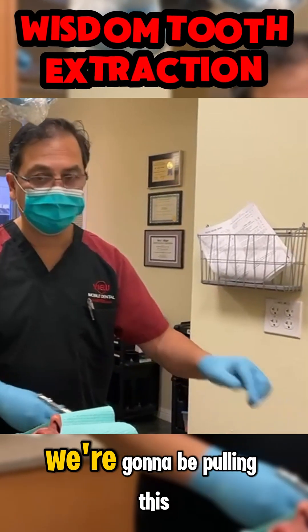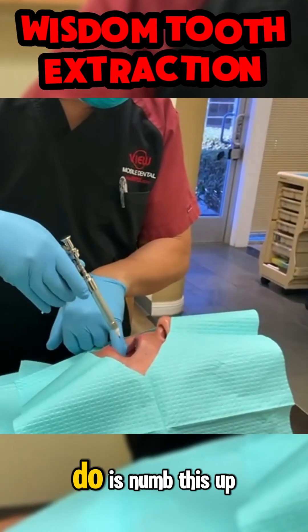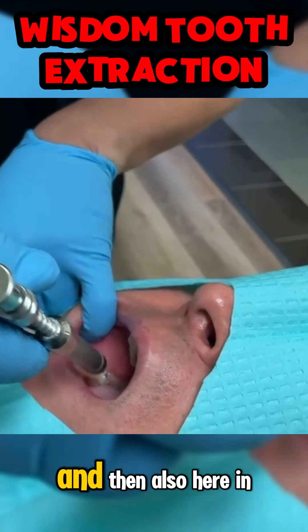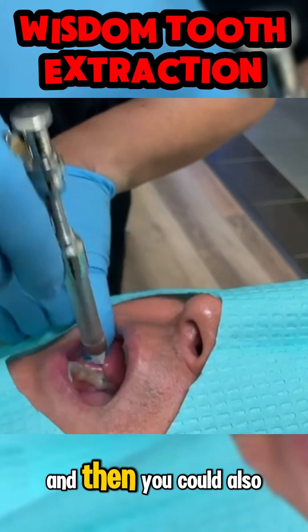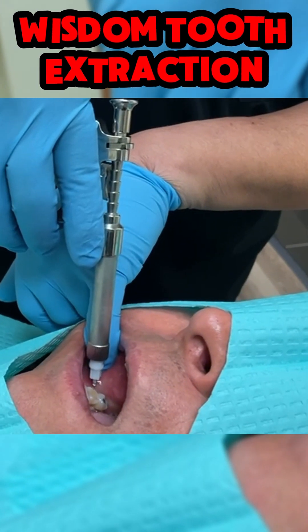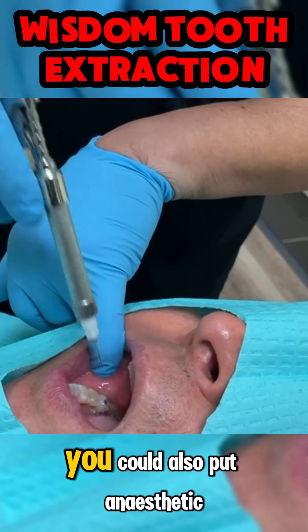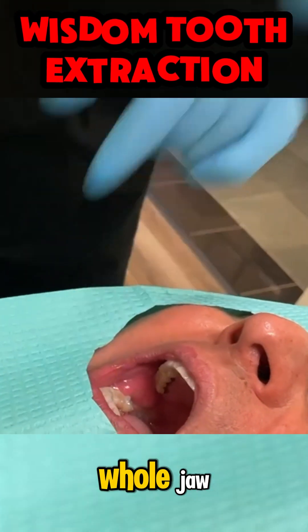What you have to do is numb the tooth up. We're going to be pulling this wisdom tooth. So the first thing you'll do is numb this up, and then we're going ahead and doing anesthetic here and also here in the lingual part. You could also put it right here on the mesial side of the teeth and then in the distal of the wisdom tooth. You could also put anesthetic up here so it'll numb up the whole jaw.